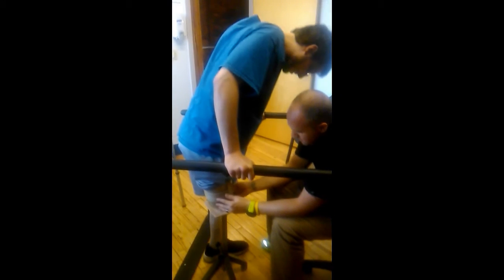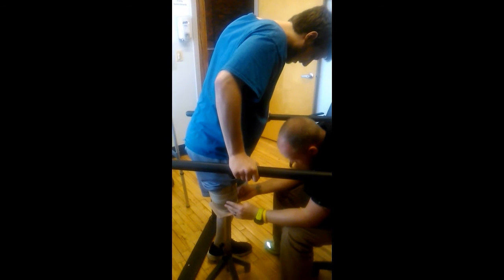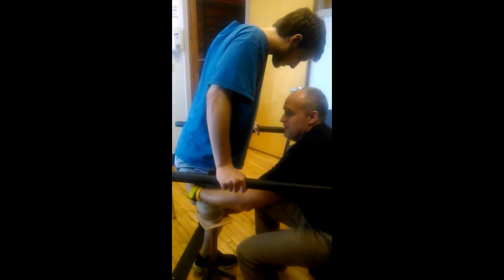Go right in. It might still be a little twisted, but it's hitting the building. Okay. Nice job. You're in there, man.